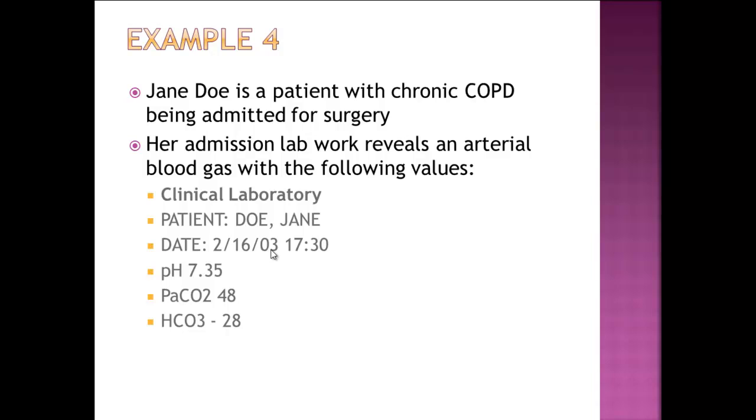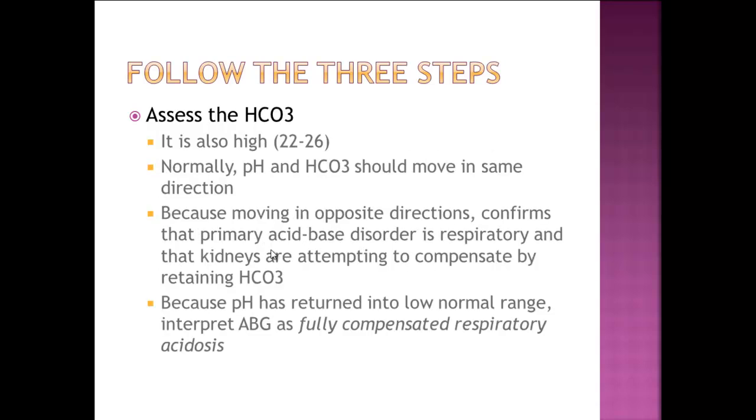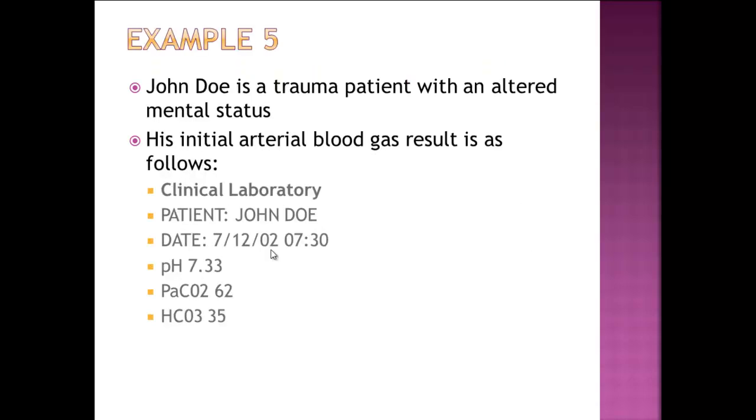So this is a fully compensated respiratory acidosis. Okay? And these are the 3 steps just talked out in longhand here as to what I just said.